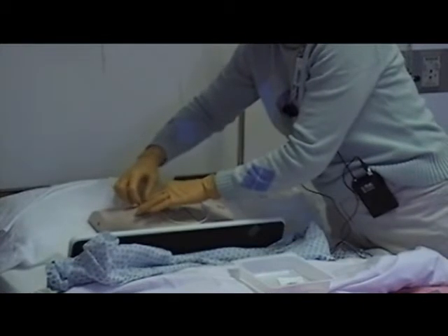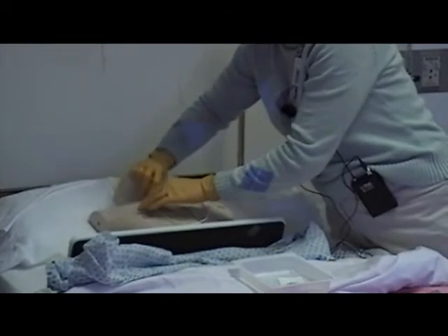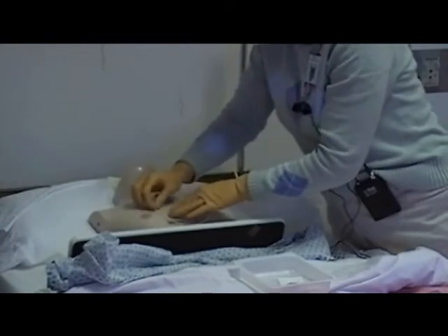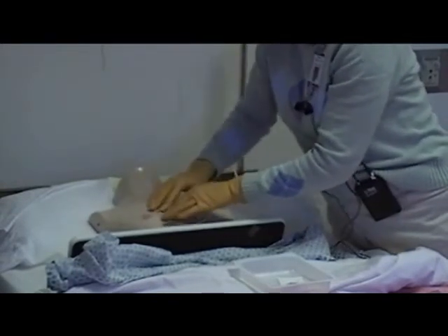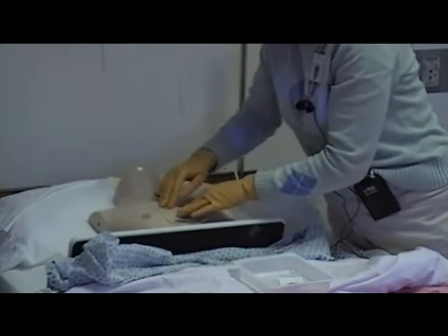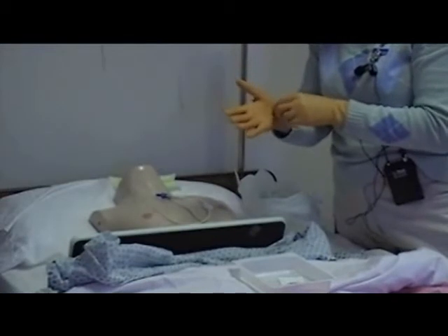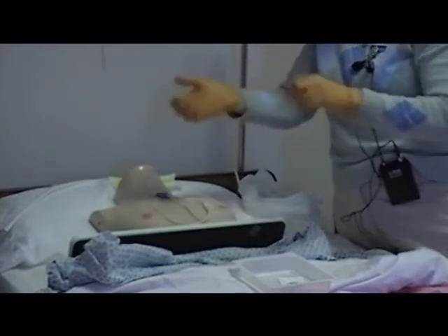And it's no longer sterile right now because the area that is covered is the area that needs to stay sterile. And we'll make sure all the edges are secured. At this point, he can remove his mask. I can remove mine. I'll remove my gloves right now.